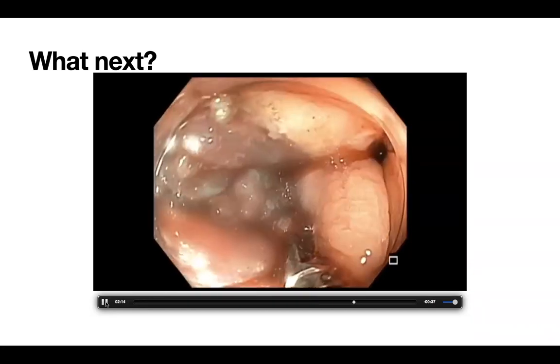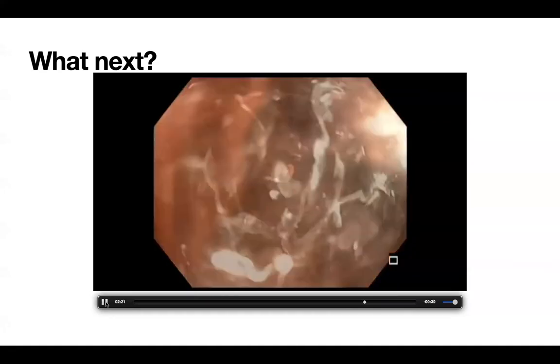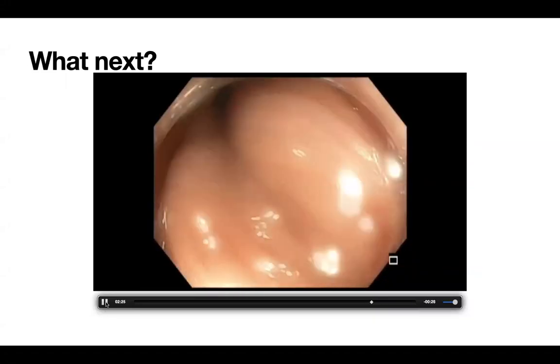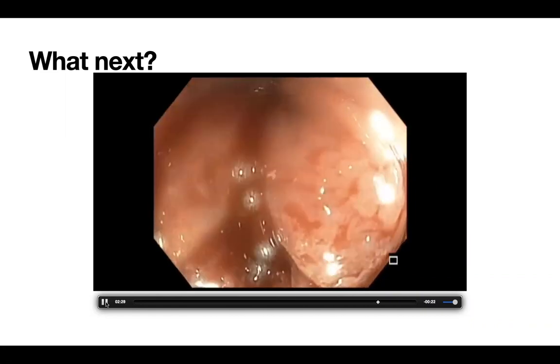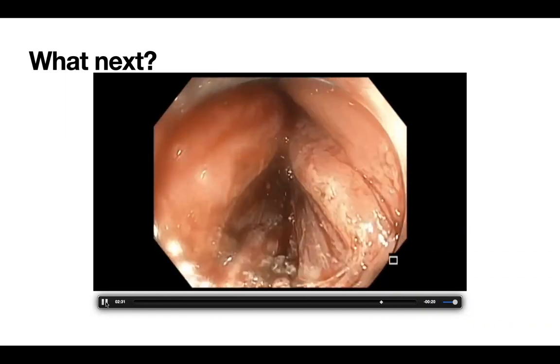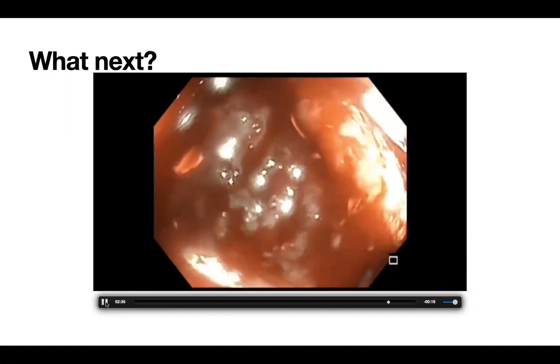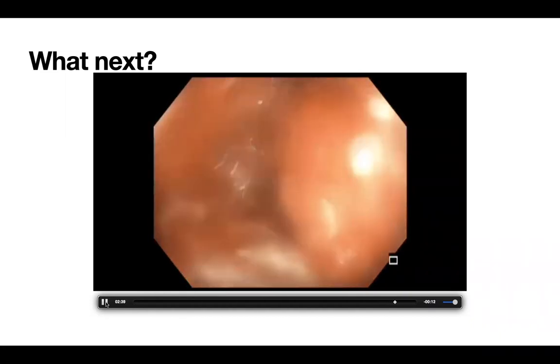But actually, the coagulation current really did not control the bleeding. Basically, it started to rebleed. And I didn't want to keep on coagulating because that area is anteriorly located, close to the prostate. So I didn't want to keep on coagulating for fear of causing some issues with the prostate.